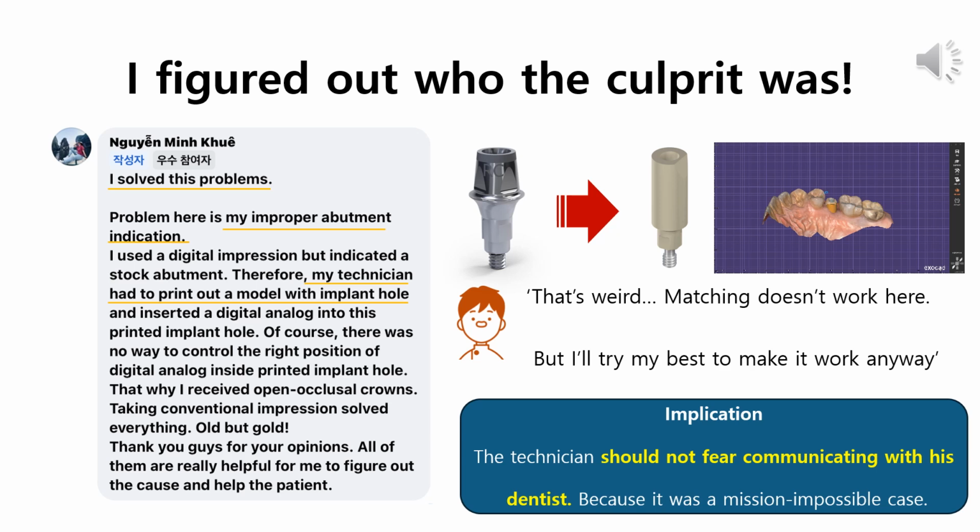This falls under Step 3 of our classification, but Step 4 also comes into play because the technician could have told him that the matching process is not normal. It shows how important communication with the technician is. Thanks to Dr. Nu Win's persistence and patience in analyzing this, we were able to finally close this case.